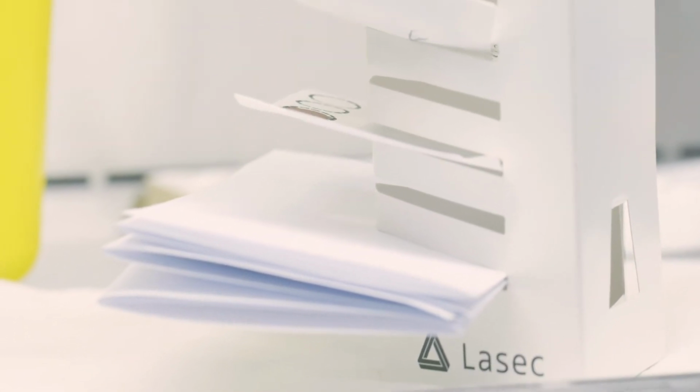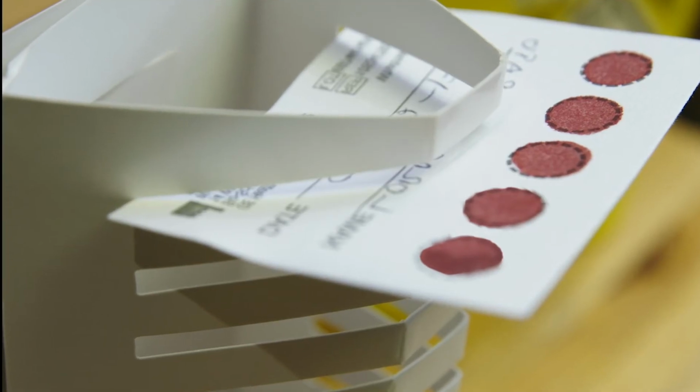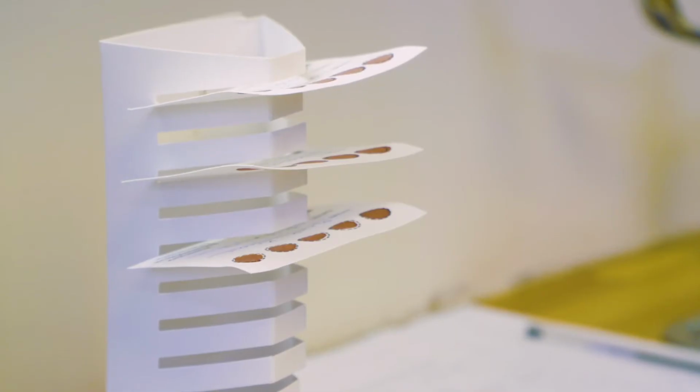Leave them at room temperature in the drying rack for a minimum of 4 hours and a maximum of overnight to dry completely. If the DBS has been made late in the afternoon, they can be left to dry overnight. When the drying process is complete, the blood spots have a uniformly dark brownish color and no red areas are visible anymore. Make sure the spots are completely dry before packaging.